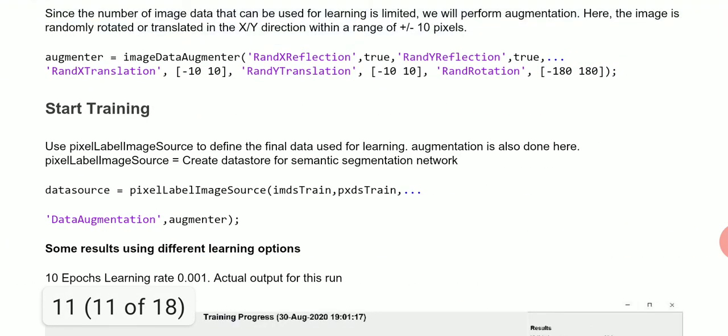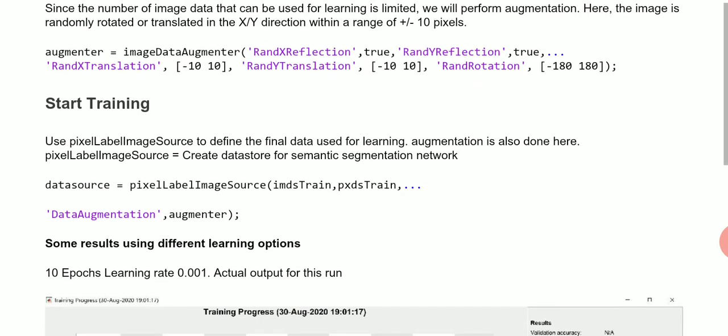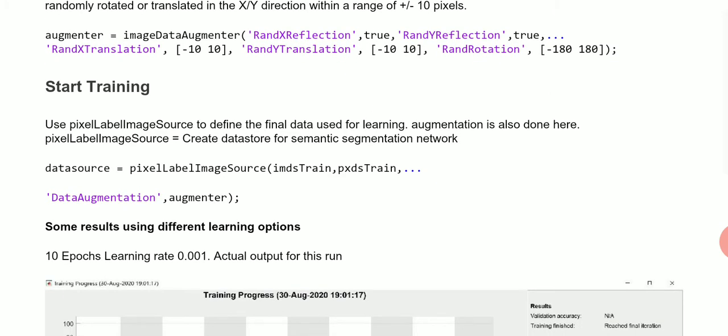Now we're going to start using the FCN, but before we do that, we want to make it a bit more robust. MATLAB has this command image augmenter, so you could rotate, scale, translate. This one here, we're just doing a bit of translation in the X and Y and a bit of rotation, just to make things slightly more awkward or a better test.